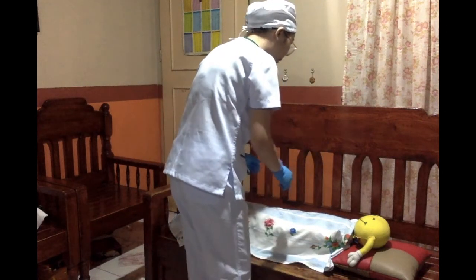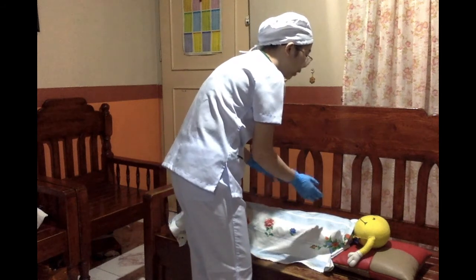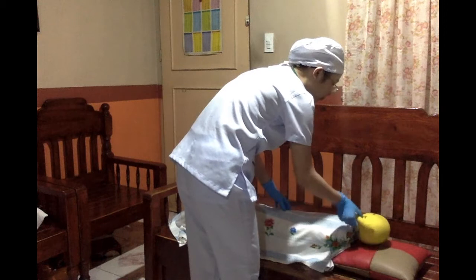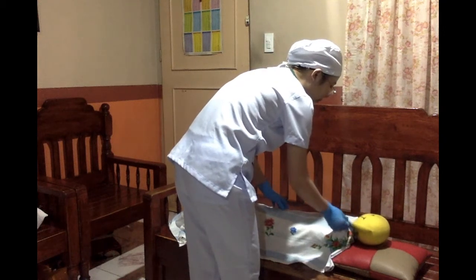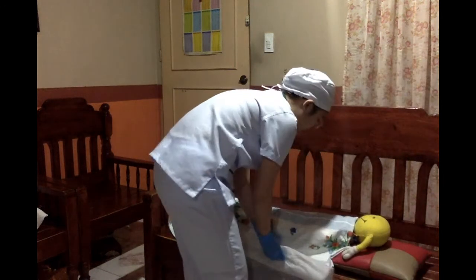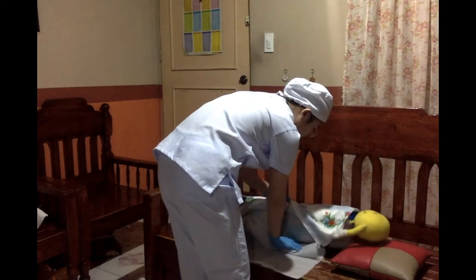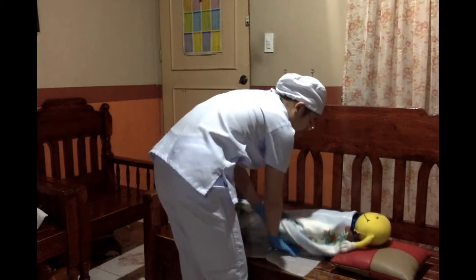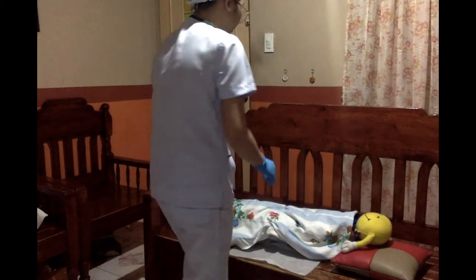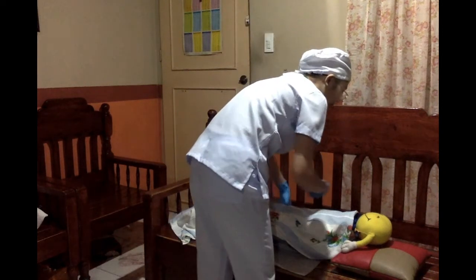Flex nyo lang po or i-bend nyo po yung kaliwang tuhod nyo. Then, kapit po kayo kay nurse na nasa kabila habang tumatagilid po kayo. Kanan na tuhod naman po yung i-bend. Tapos, kapit po kayo sa akin habang tumatagilid po.